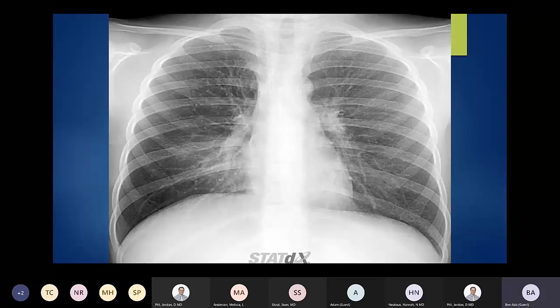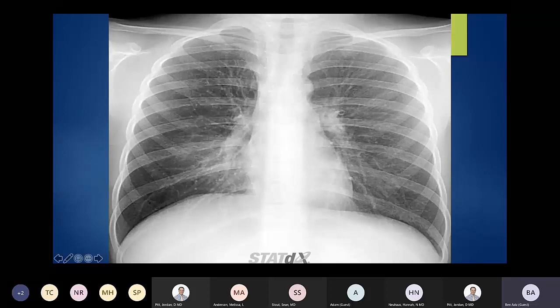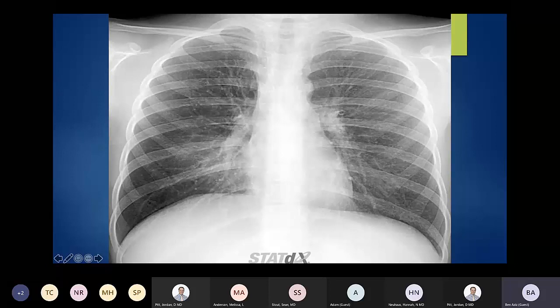With significant bronchiectasis over time, you can get associated atelectasis — the lung collapses. On this frontal chest radiograph, there are some ill-defined reticular opacities bilaterally. Down here, we kind of lose the border of the heart. On the left there's a really well-defined left heart border, but on the right side we lose it a little bit here — we're dealing with right middle lobe atelectasis. You can see a dilated bronchus here, so we've got a little bit of bronchiectasis with right middle lobe atelectasis.